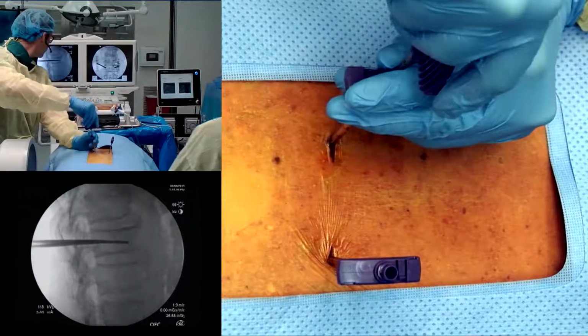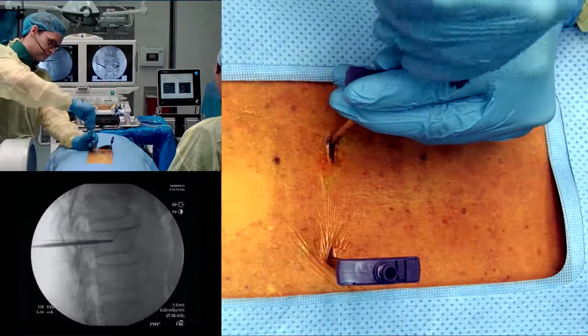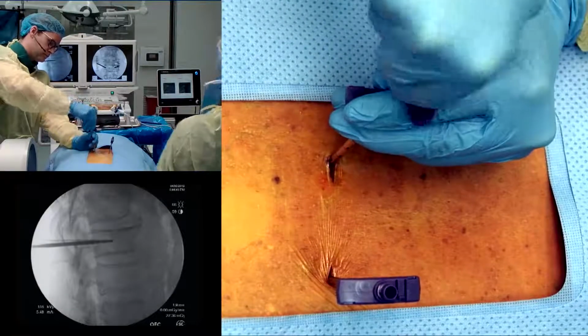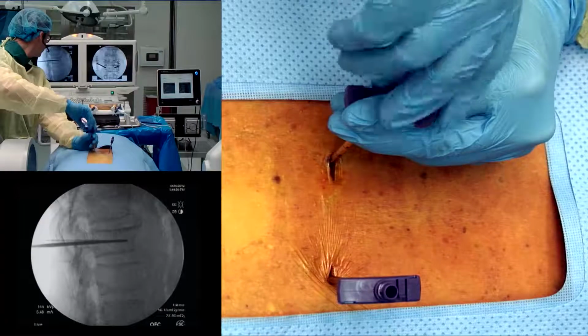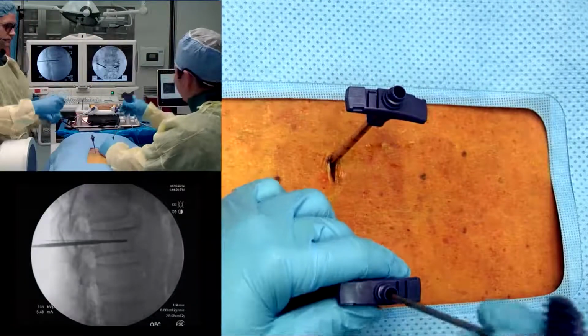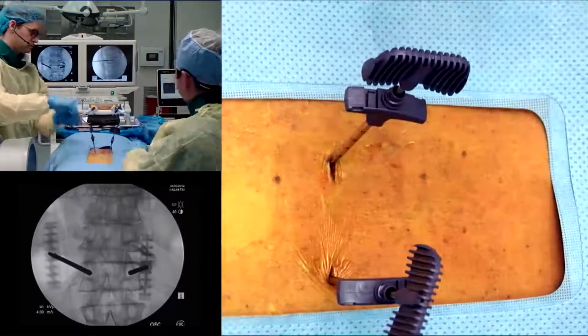Let's see a shot there. X-ray. Good. That looks great. And so why don't we do one thing? I'll take my drill back, and then we're going to go to an AP X-ray to see where we're at. So, keep it in there. Let's see where we're at on an AP view. Picture that.